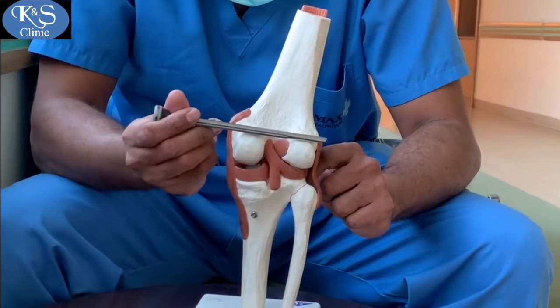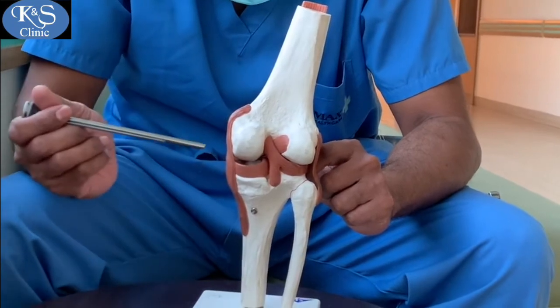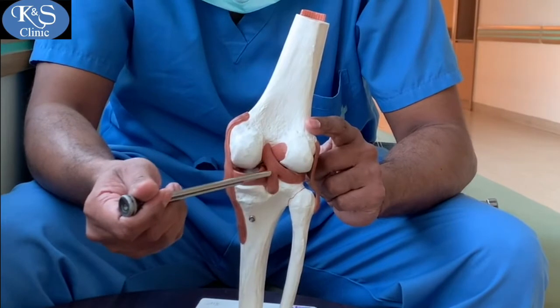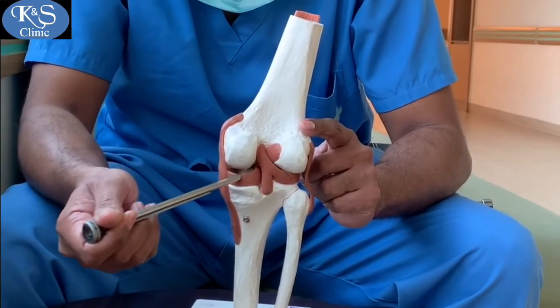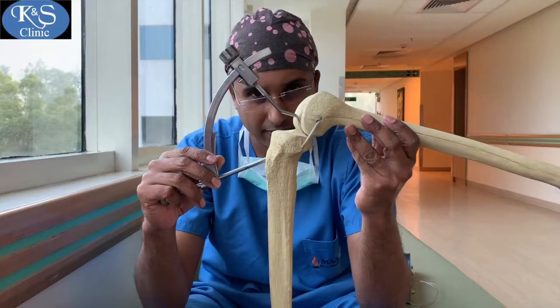Once this is done, introducing the scope from either the posteromedial or posterolateral portal gives you a full view of the back of the tibia and where you need to drill at the PCL footprint. The tibial jig is introduced through the notch all the way to the back of the knee.